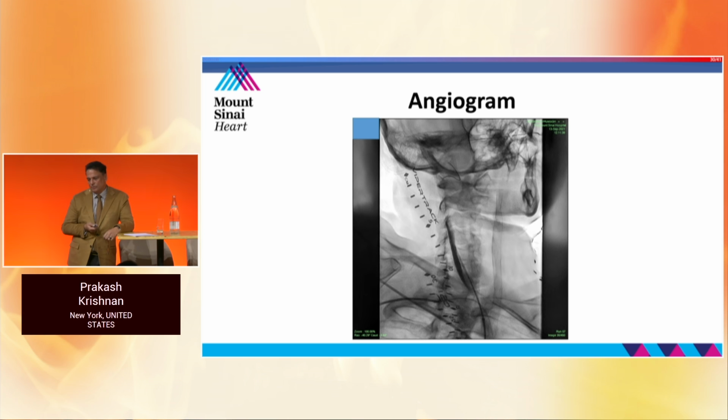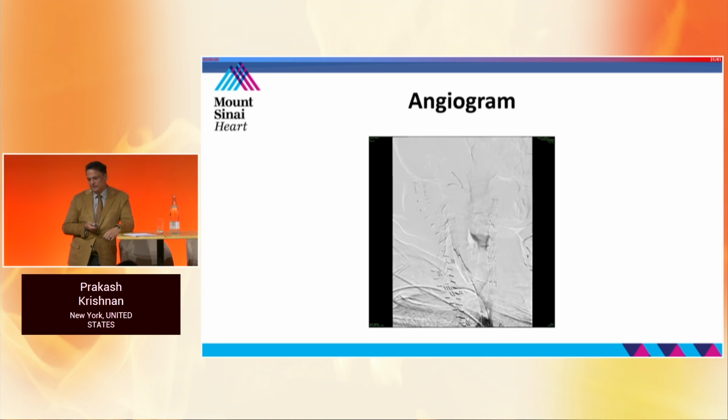We found what we thought was a distal plane with IVUS. So we found where the tear was sort of communicating, and we were able to confirm we're in the true lumen, and then we went ahead and put a stent there. And after the stent, we still had no flow because of the common carotid. And IVUS demonstrated that the tear was intraluminal at the level of the ostium of the common, and we were in the lumen between the tear and the dissection.